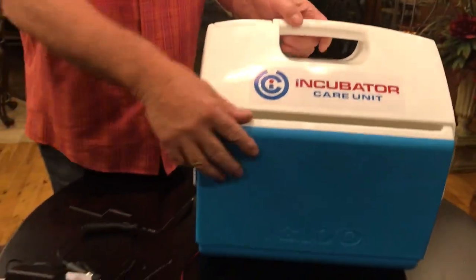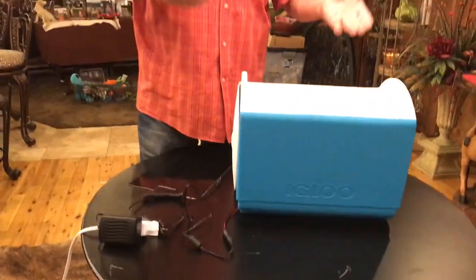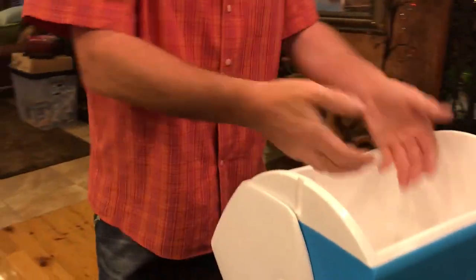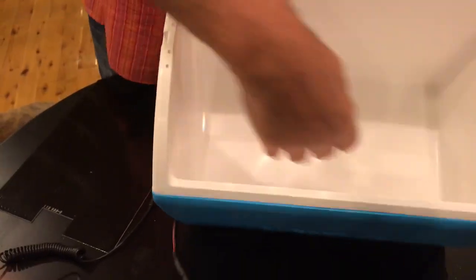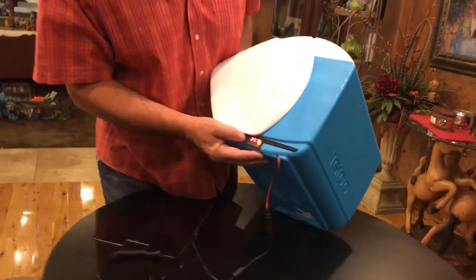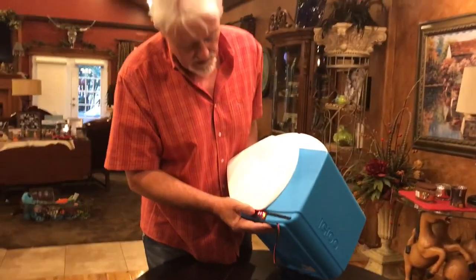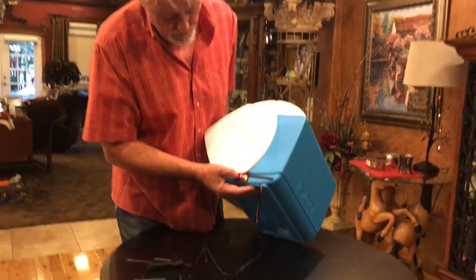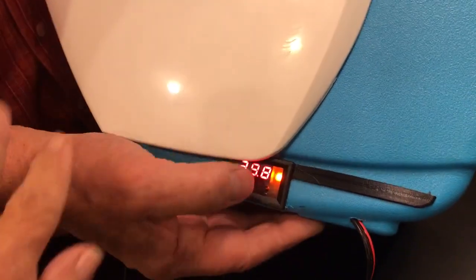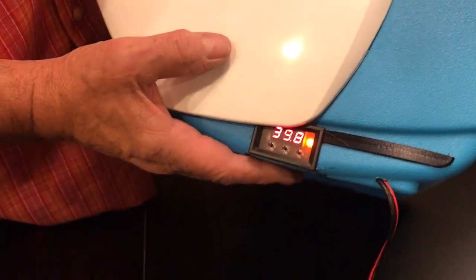I feel better. You can leave the thing open because here's the deal: the heat's coming up through the floor. It's not that there's a fan and a heater or a light bulb blowing air. It's all coming up. Even when this is open, that floor temperature will stay at 40 degrees. And it says 39.7, the heat is on. And here in a few seconds, 39.8, which is, remember, darn close to 40, which is about 104 degrees, the right temperature for a puppy.